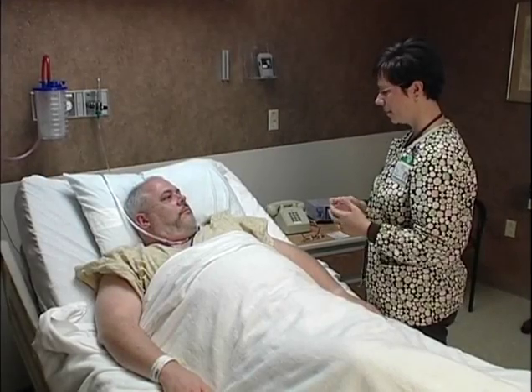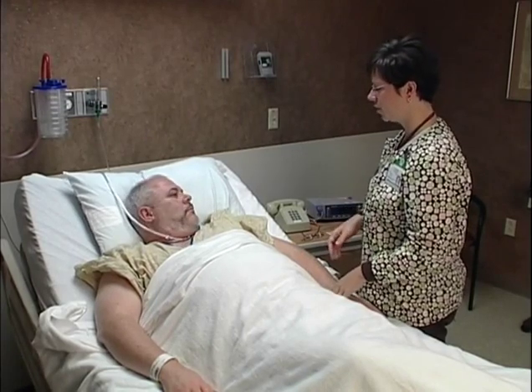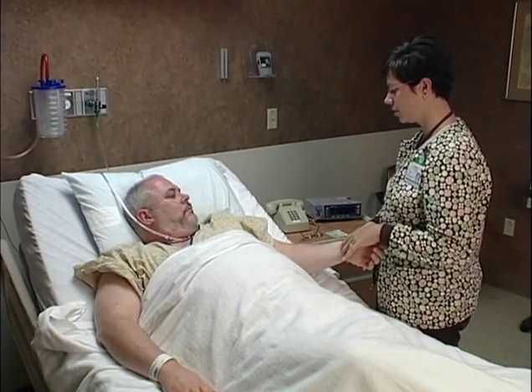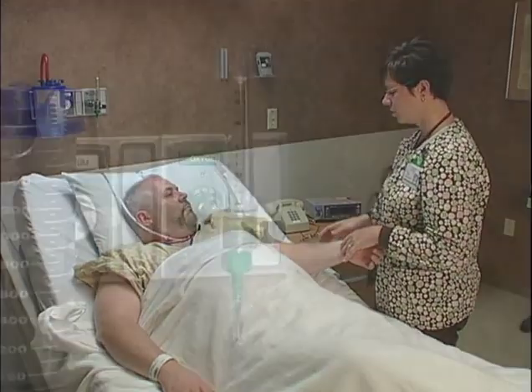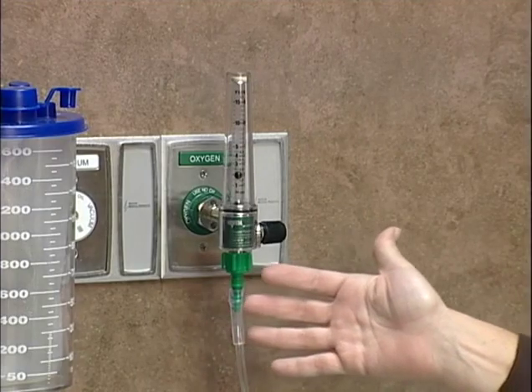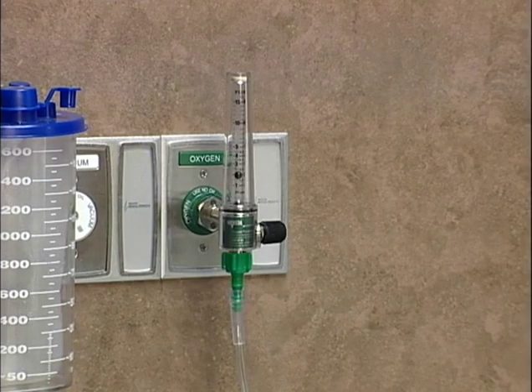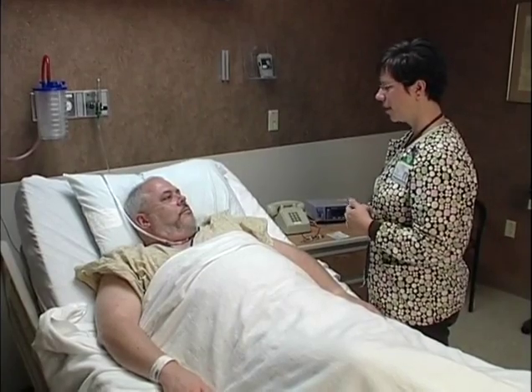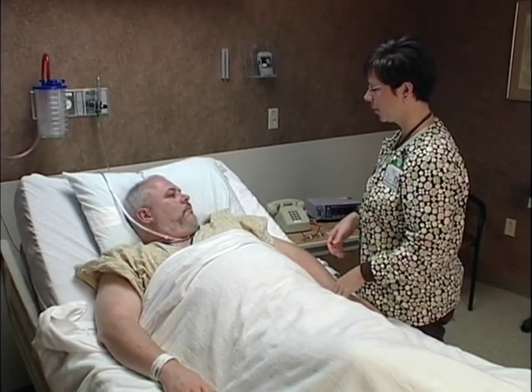Explain to the patient what will occur in a reassuring manner. Attempt to calm anxious patients, since hyperventilation can temporarily alter blood gas levels. For patients receiving ventilator support or oxygen therapy, verify that the therapy has been constant for at least 20 minutes prior to collection. Patients on room air should sit or lie comfortably for 5 minutes prior to sampling or until breathing is stabilized.